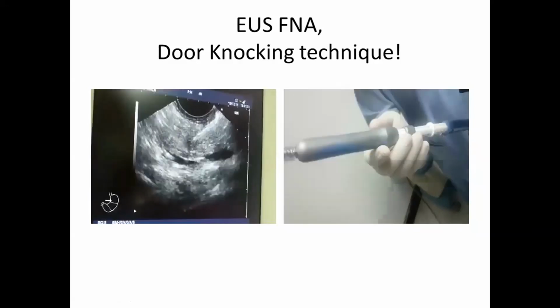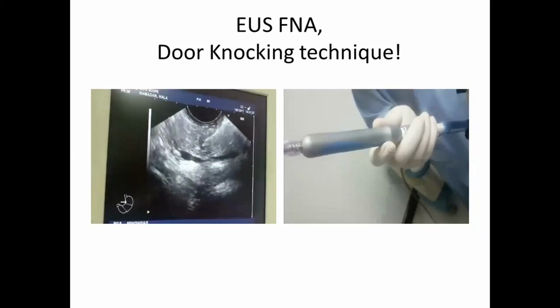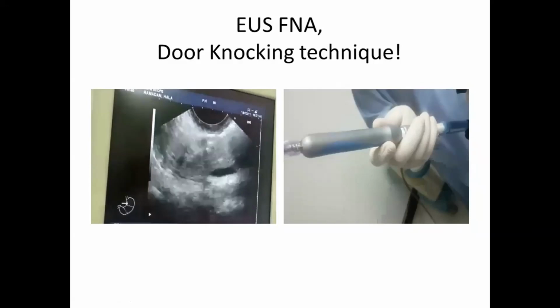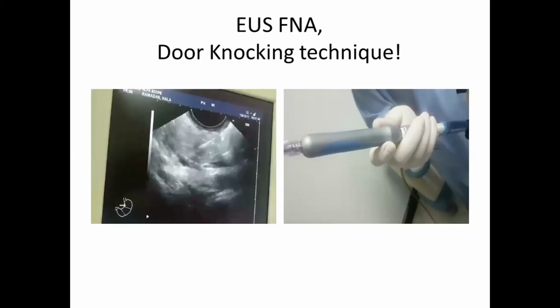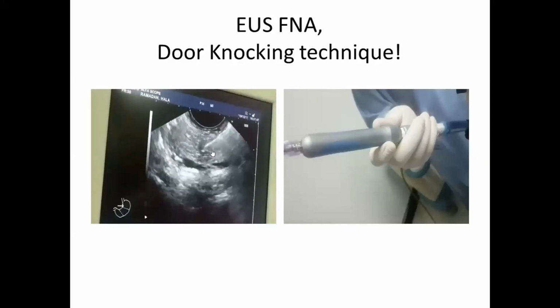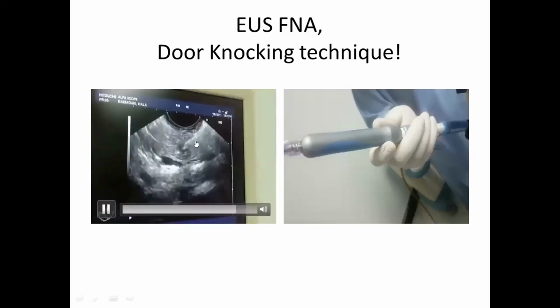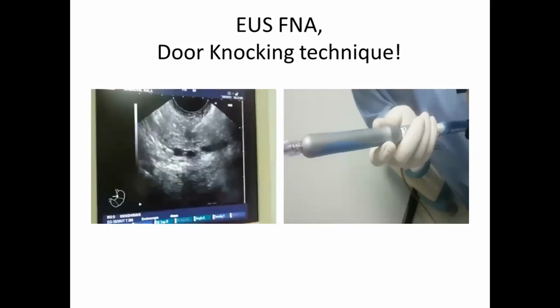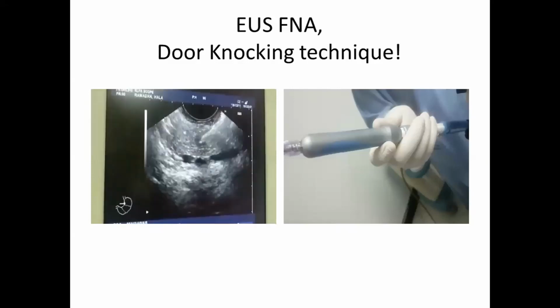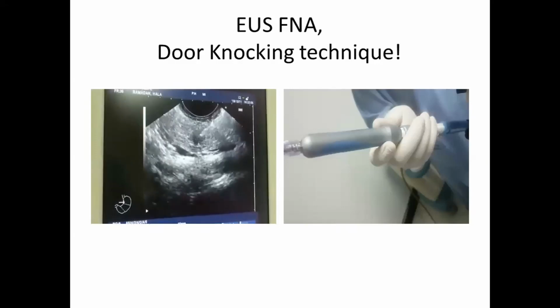So it is a very difficult mass because it is small, so the range of movement inside is very limited. It is 9 millimeter, very firm and located in a soft normal pancreas. Now, very nice. We are now starting to move inside the mass. And fortunately enough, the cytopathological diagnosis was low-grade duct adenocarcinoma, and the patient underwent partial pancreatectomy.